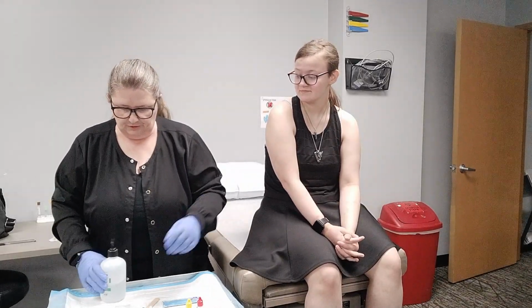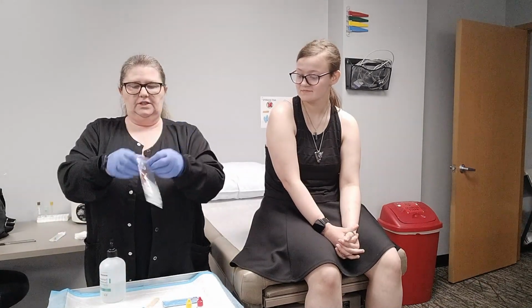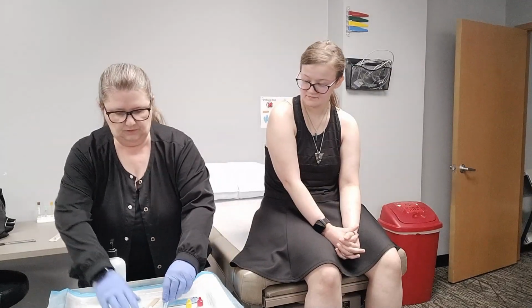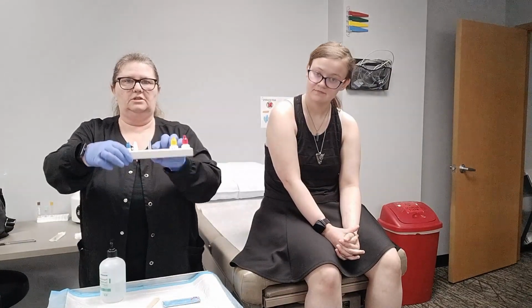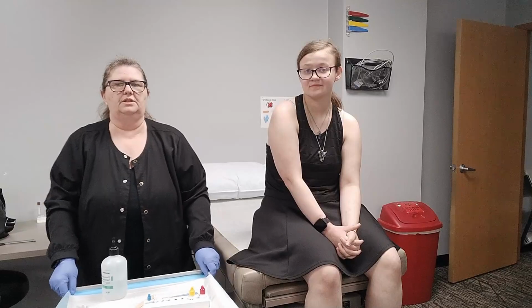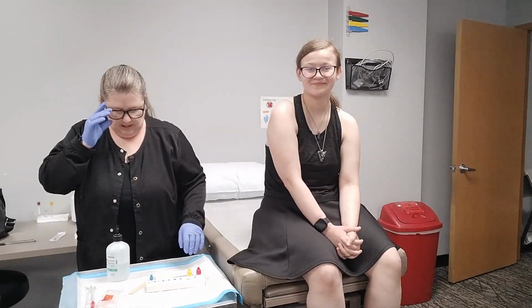All right, so first and foremost, I'm going to go ahead and get one of these test tubes out. And I am just going to place it right in here in my little holder, okay? Let me pull this back just a little bit so you can see it better. Okay.